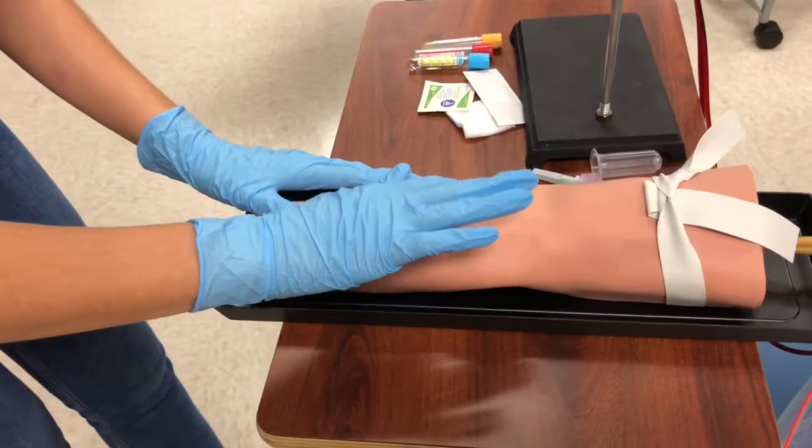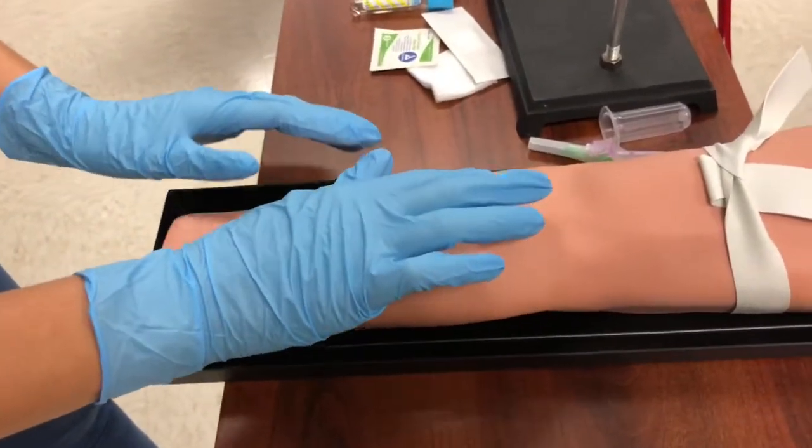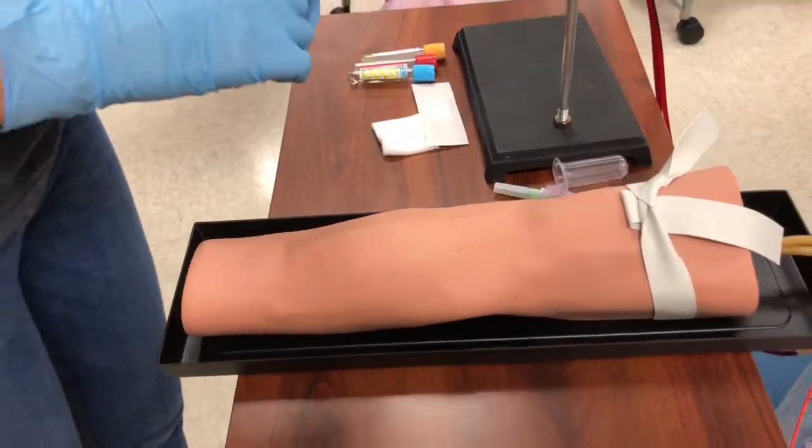Now I palpate for the vein. I want to make sure the vein feels bouncy so that I'm not poking a tendon or nerve or anything other than a vein.